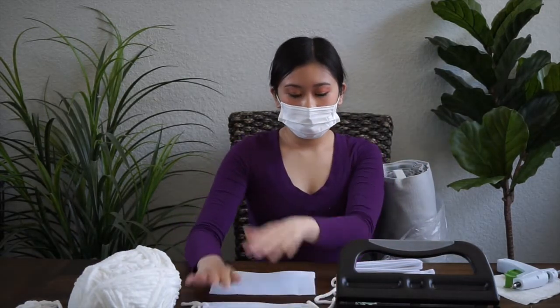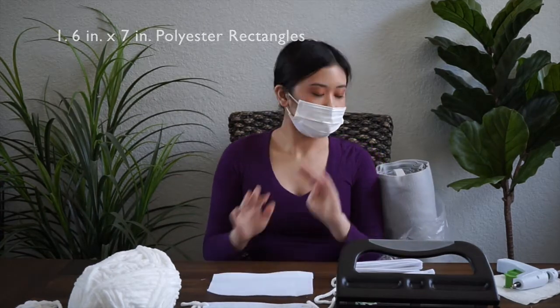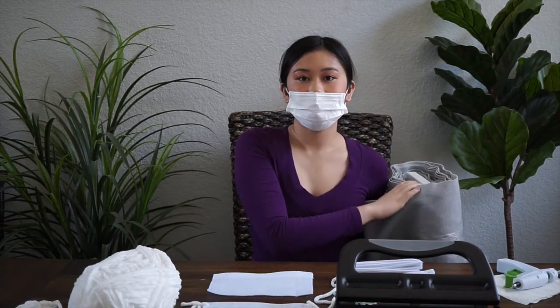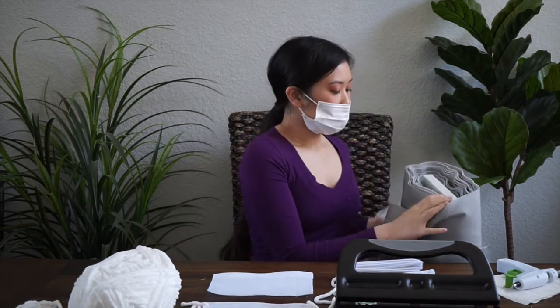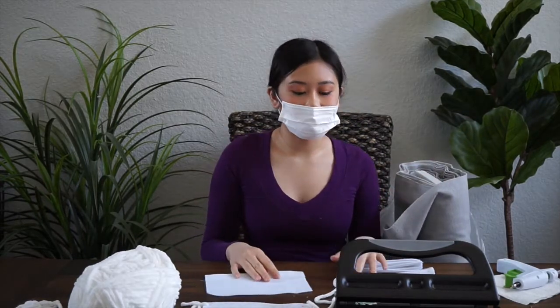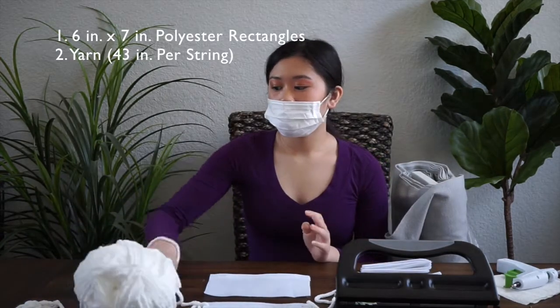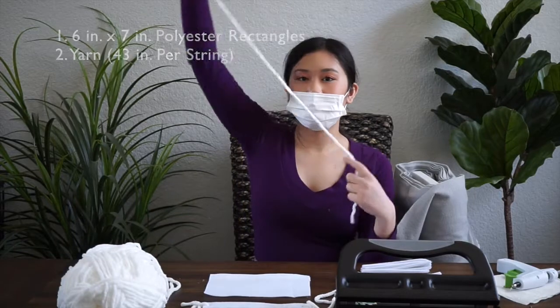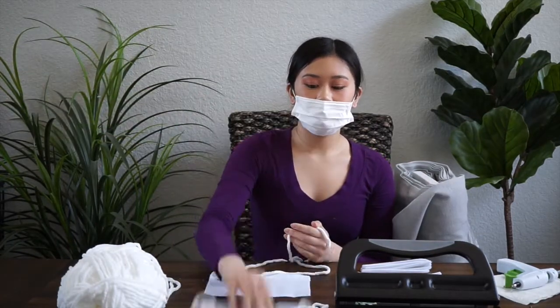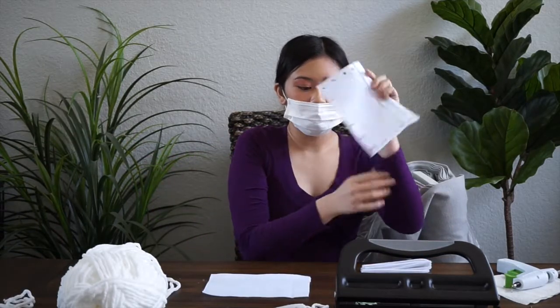So what you're going to need are 6 by 7 little rectangles of polyester fabric because it is moisture resistant and it's also breathable. So you can get like a yard of the white ones for like $6.99 at Joann's. And then you're also going to need yarn. You're going to have to cut it into like about 43-inch strings to be able to wrap around everything.